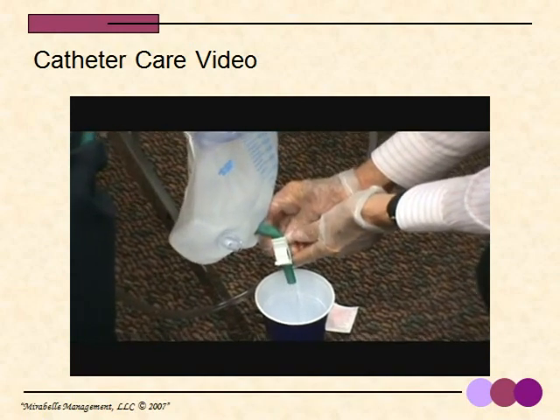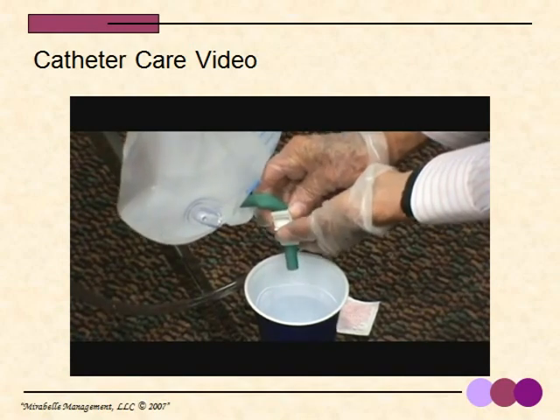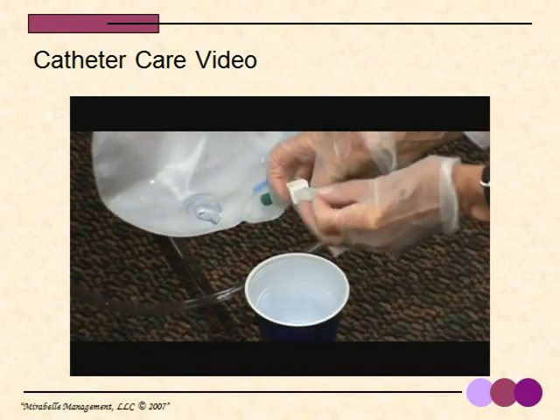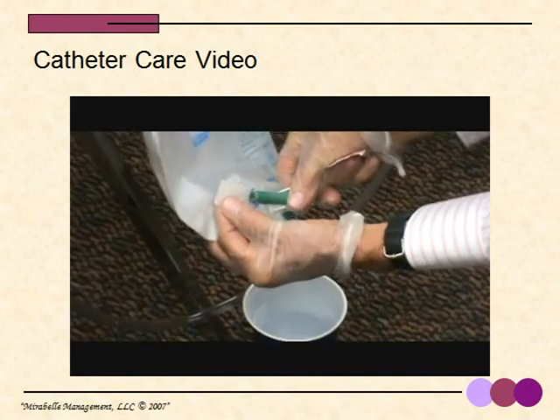And you allow the urine to flow into the container. Now we'll say that the urine bag is empty. You close the drain. I have an alcohol wipe. I want to cleanse that tip well inside before I insert it back into its sleeve.